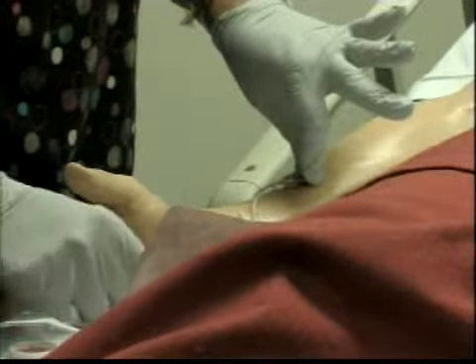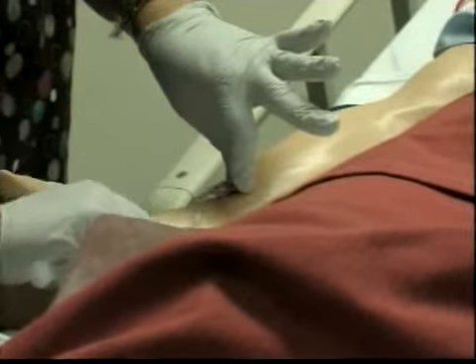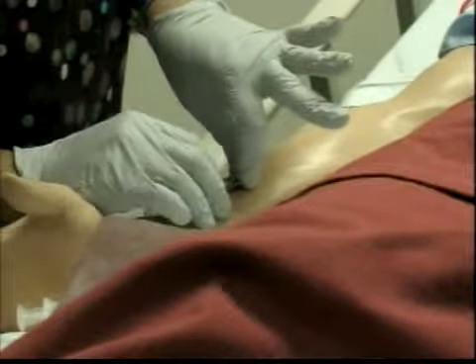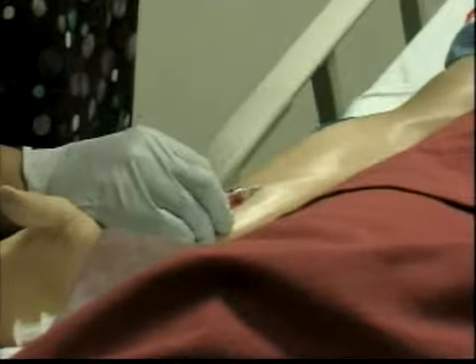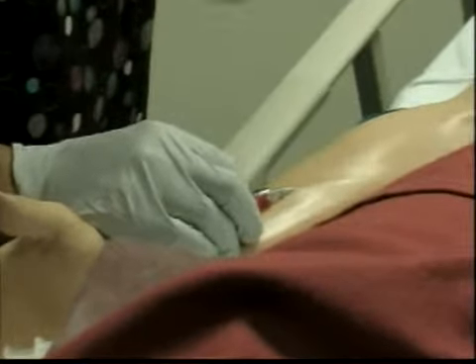I put the needle back into the cap in there so I can put it in the sharps container, and it's covered and it's at low risk of giving me any puncture. So I just want to make sure that I remove this with my hand. Okay, and then I'm going to tell my client, will you please remain still for me, because now I'm going to tape it. I let go of that, but I'm holding it at the same time just to make sure I give the patient enough time to register that and say, yes, I'm holding still.